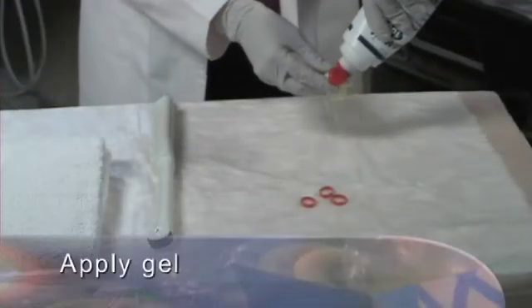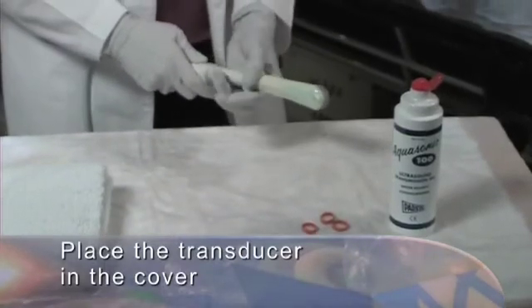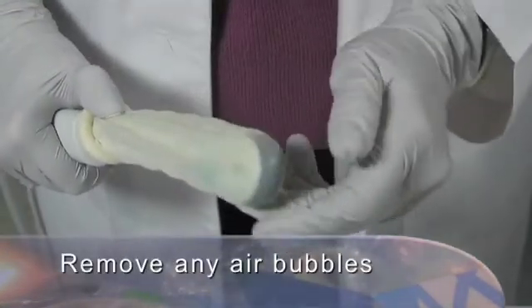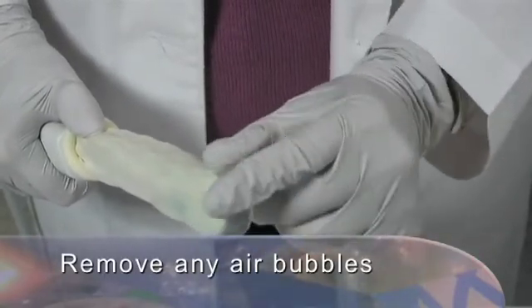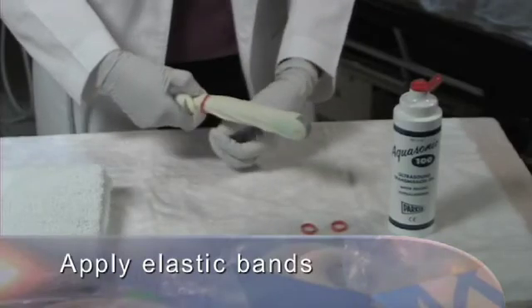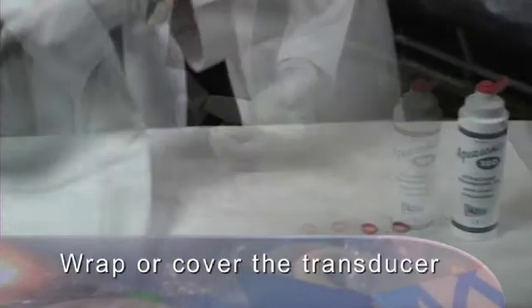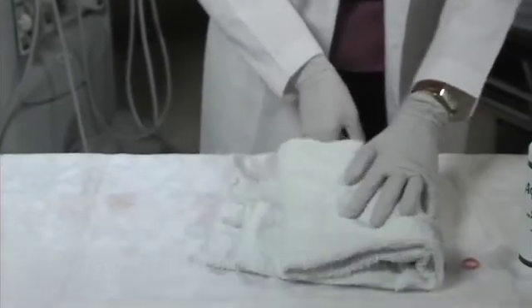Apply gel inside the transducer cover, and place the transducer cover onto the transducer. Check carefully and remove any air bubbles that are between the transducer face and the transducer cover. Some labs use elastic bands to secure the cover. When done, wrap or cover the transducer until ready for use.